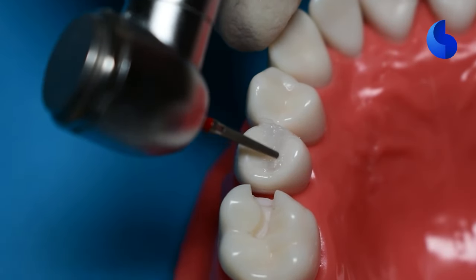So at this point, our restoration looks pretty good. You can see that occlusal surface has a really good definition. And that all starts with the way that we condensed our composite material when we started off with the restoration. So keep your final result in mind as you're going through with it.